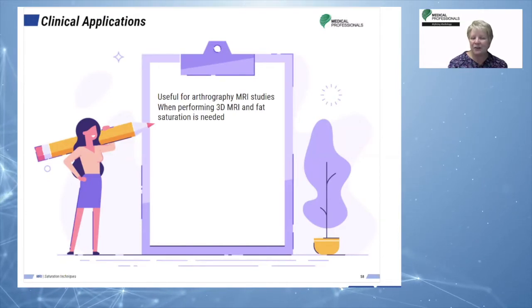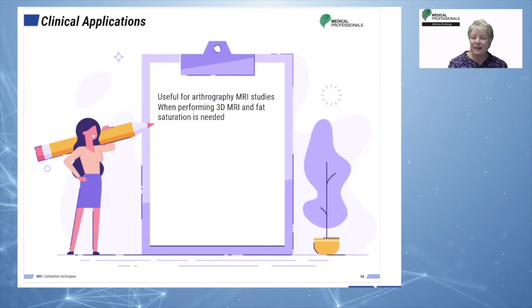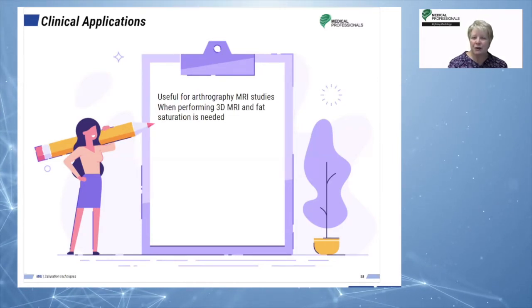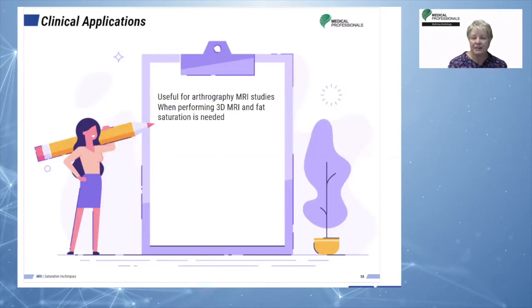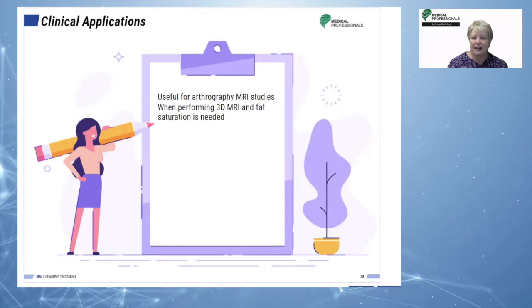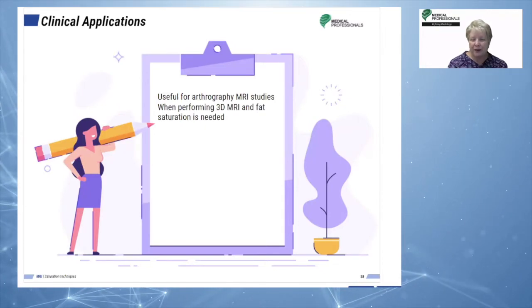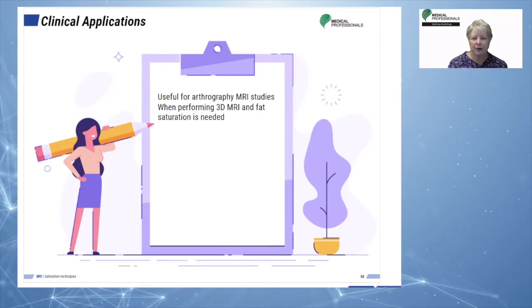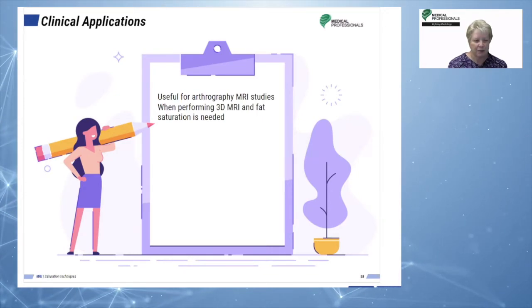Disadvantages are that a good shim is necessary because inhomogeneities are an issue, and manual adjustments to transmitter frequency are often necessary. Water excitation is a chemical shift dependent method, making it a little less desirable as well, because we know we don't always have success with chemical shift.